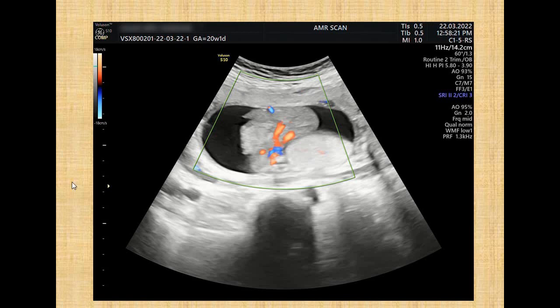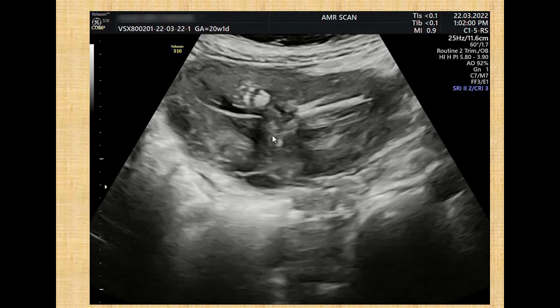I'm sure that many of us have considered this as probably an abdominal wall defect with herniated abdominal content into fluid, but actually this was marked abdominal ascites when the baby has severe oligoamnios. When we looked for other fetal parts and the wall of the uterus, we became sure of this fact.